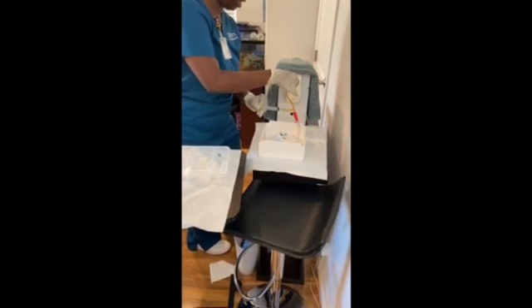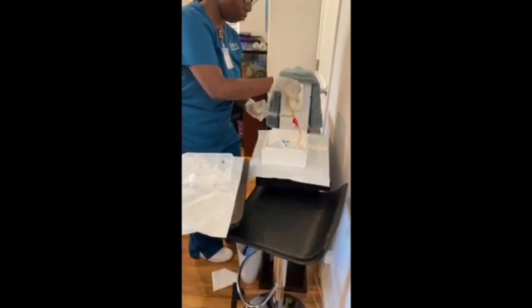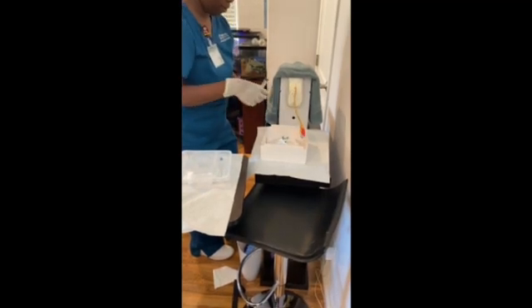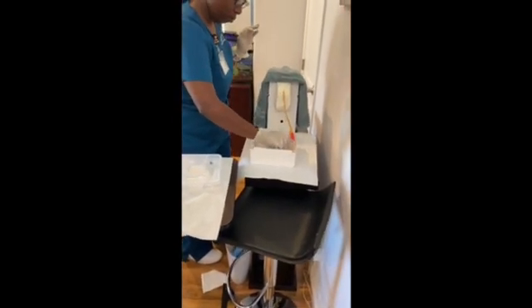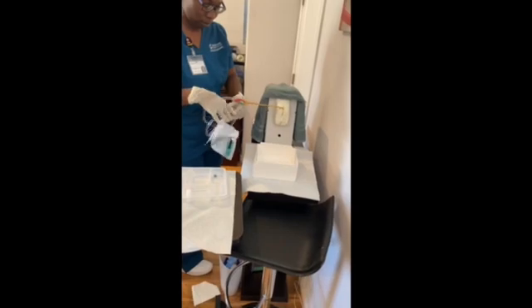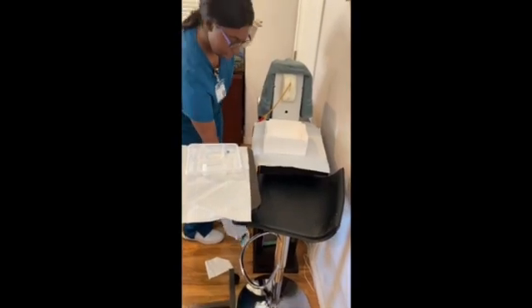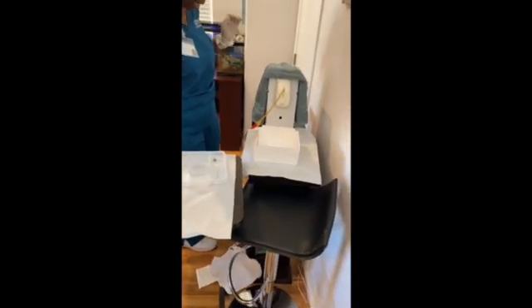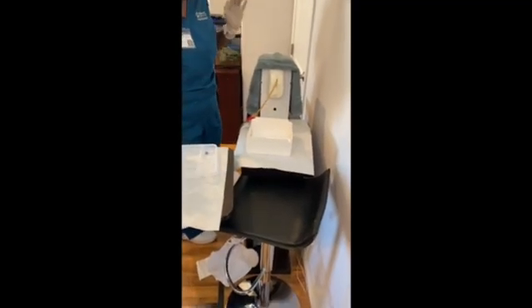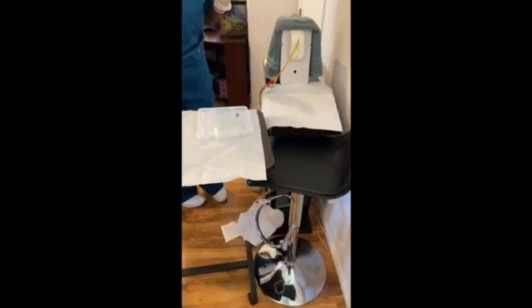Okay, so I feel that there is a little bit of resistance, which is good, meaning the balloon is inflated. So I can go ahead and remove my non-dominant hand off of the tube to take that off. Just gonna hang this on a non-movable part of the bed, as well as place a stat lock on the patient's catheter so it doesn't get yanked out. Okay, so this also would go in the trash, but I cannot fit it in my trash.